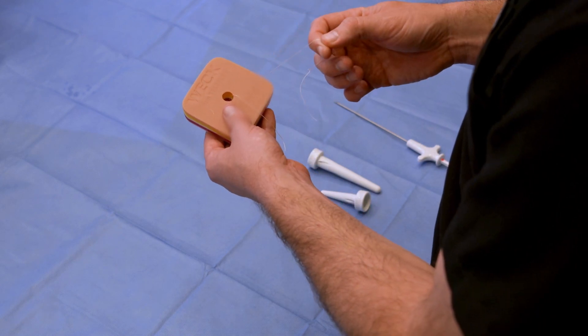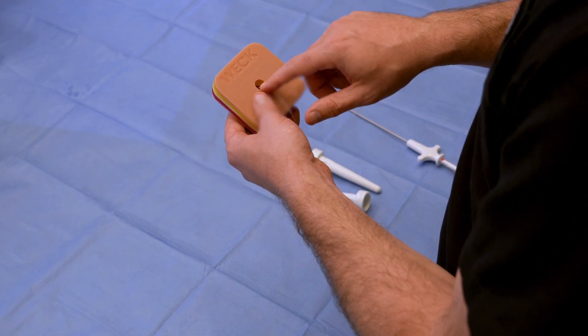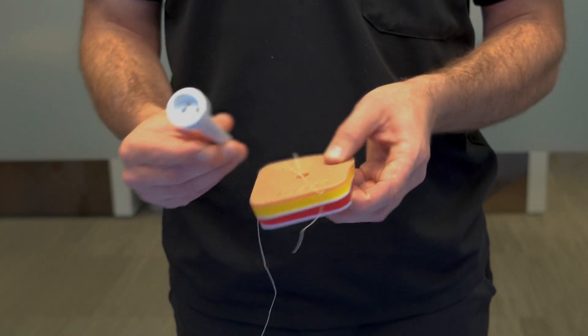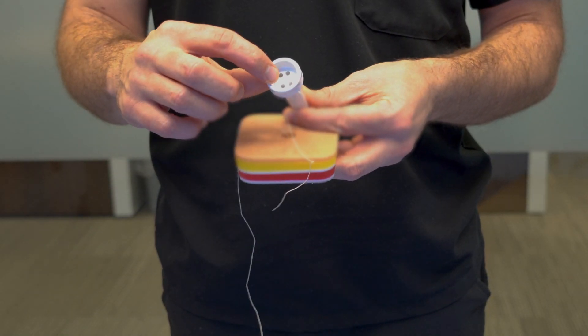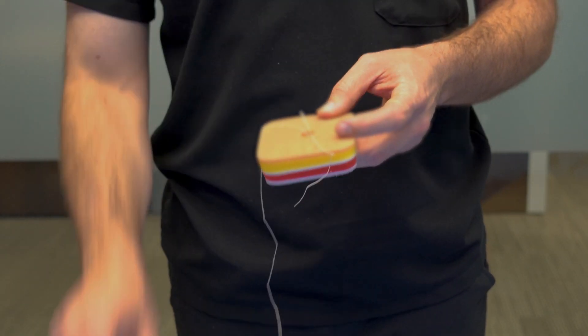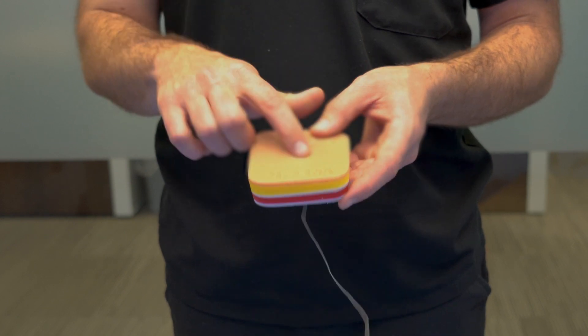Complete the closure by using standard suture tying techniques and inspect the incision site by palpating the defect. If using a 15 millimeter pilot guide, repeat the steps with two different channels. If required, use another piece of suture with the remaining two channels.